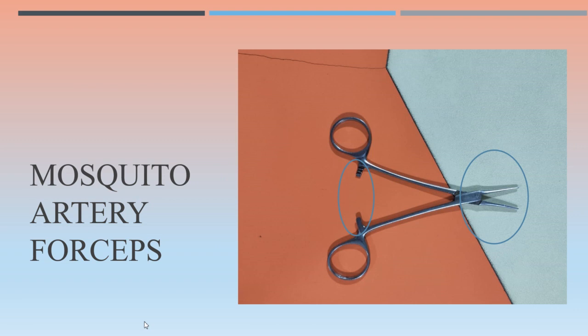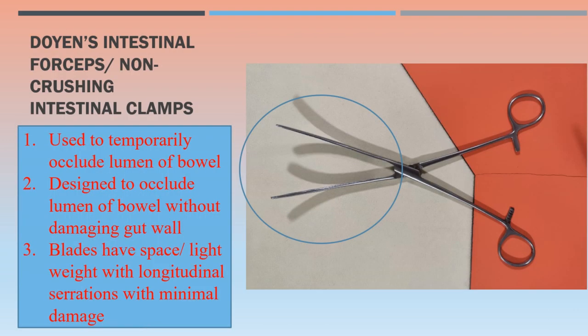Mosquito artery forceps. Next, Doyen's intestinal forceps, also known as Doyen's non-crushing intestinal clamps — this is used to temporarily occlude the bowel lumen and is designed to do so without damaging the gut wall. The blades have a space and are lightweight with longitudinal serrations, which minimizes damage. This instrument has a lock for occluding the lumen of the bowel.